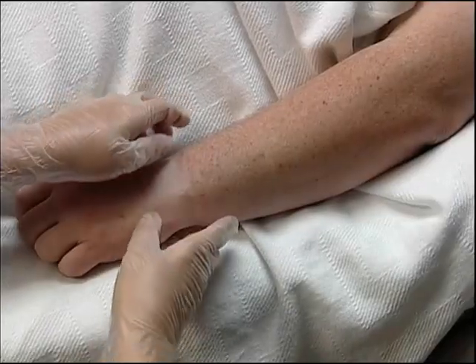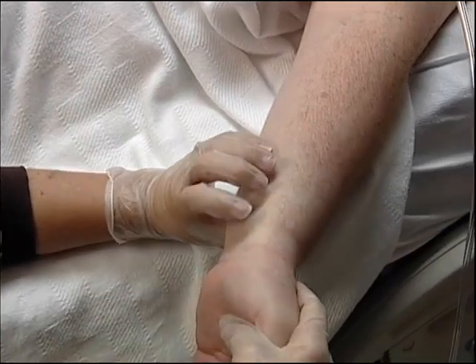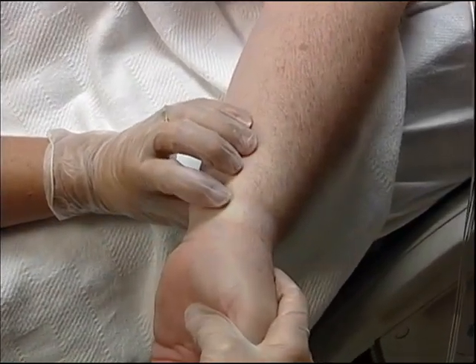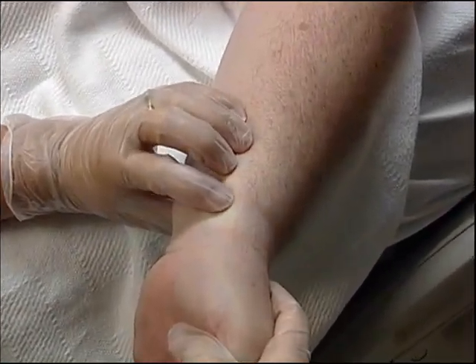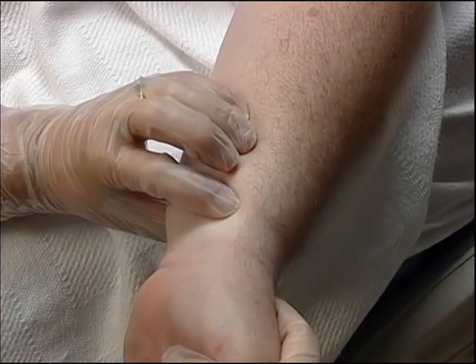To locate the radial artery, apply pressure using your index finger and locate a pulse. Typically, the radial artery lies close to the wrist in the depression between a tendon and radius of the lower forearm. Keep in mind that detecting a pulse may sometimes prove difficult, as with obese patients and patients experiencing low blood pressure or a weak pulse.